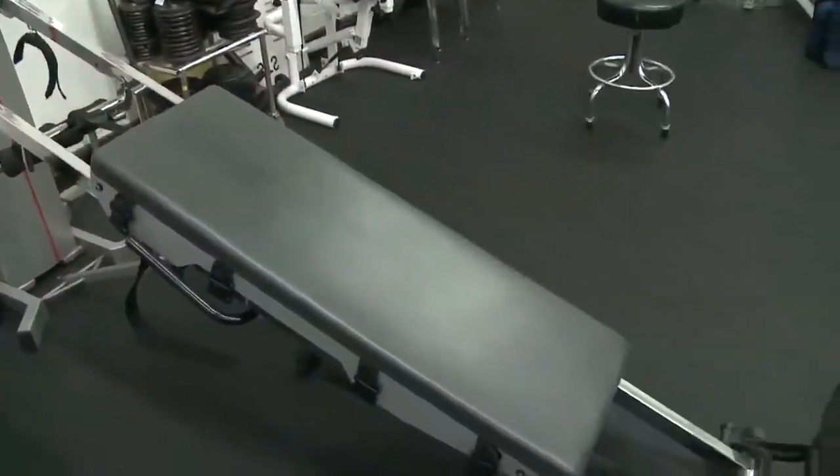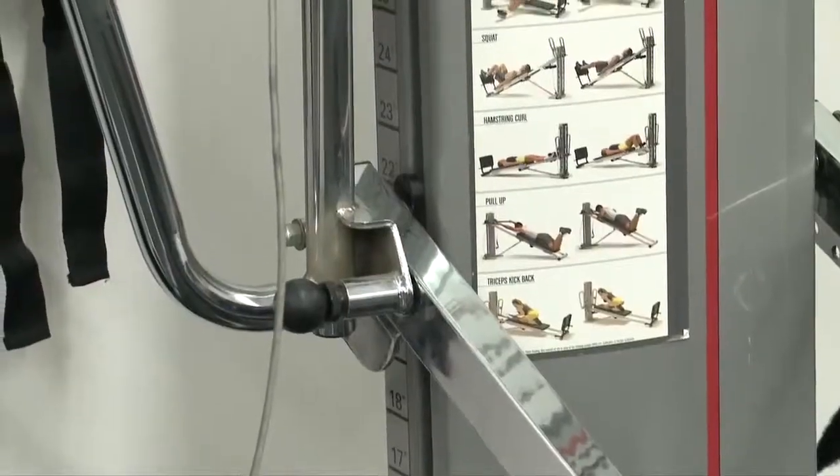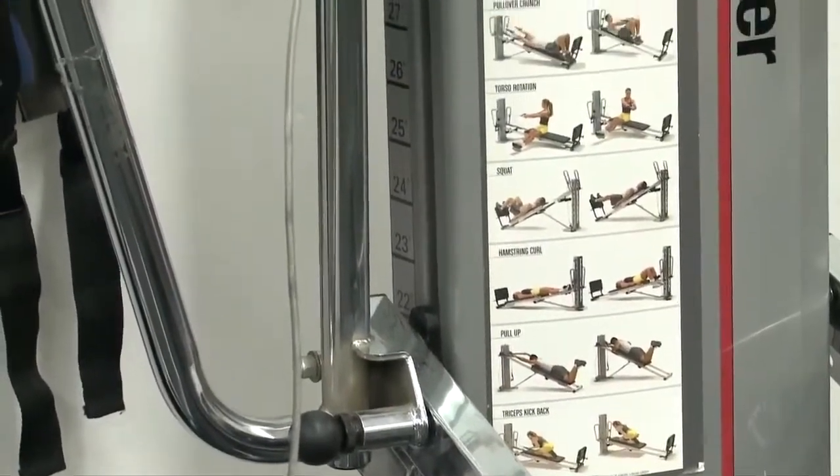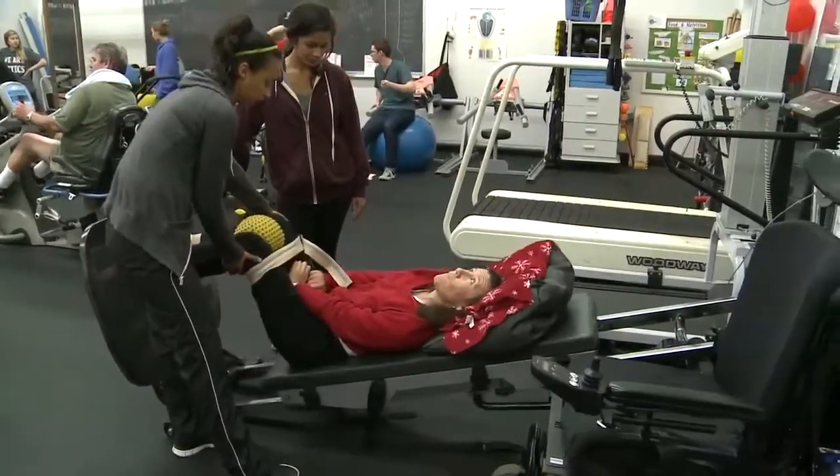This is the Power Tower Total Gym. The Power Tower allows for incremental load changes during exercise. We use it primarily for partial weight bearing squats and unilateral leg exercises.